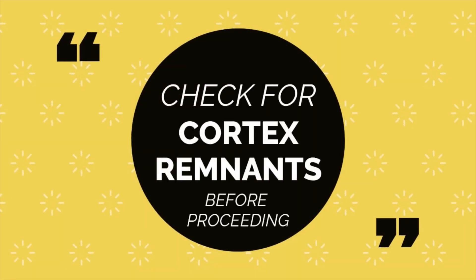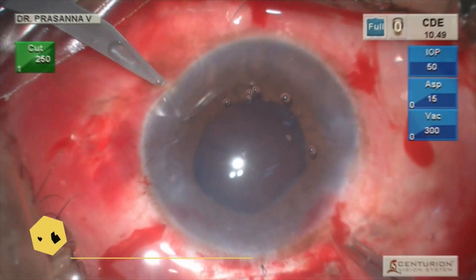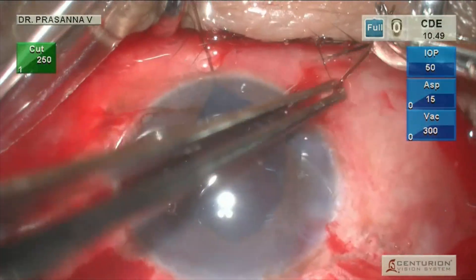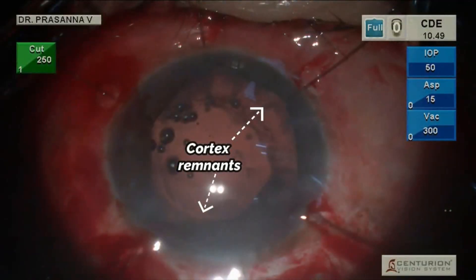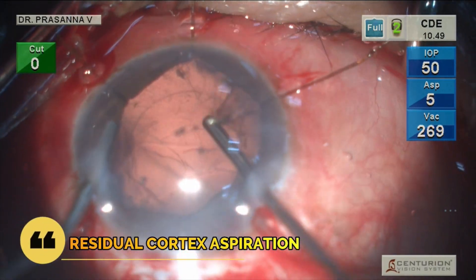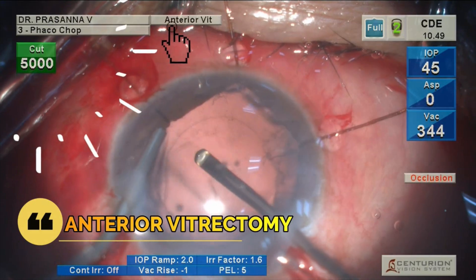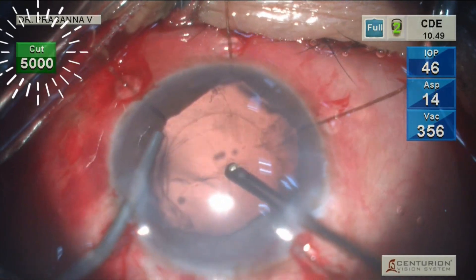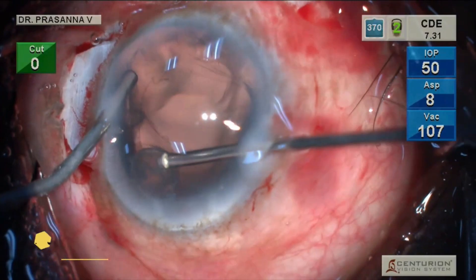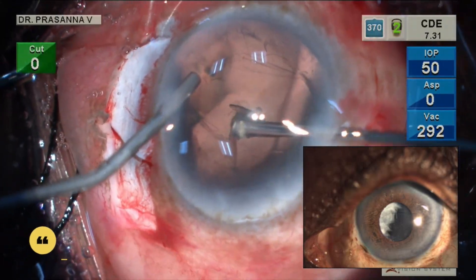Once vitrectomy is done, it is crucial to search for hidden cortex remnants and remove them. If an occasional vitreous tag is noted, one can switch back to anterior vitrectomy mode and then proceed with cortex removal. Dry aspiration with a Simcoe cannula can always be done. Leaving behind large chunks of cortex can lead to significant intraocular pressure spikes post-operatively.